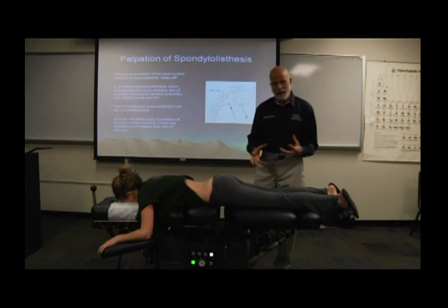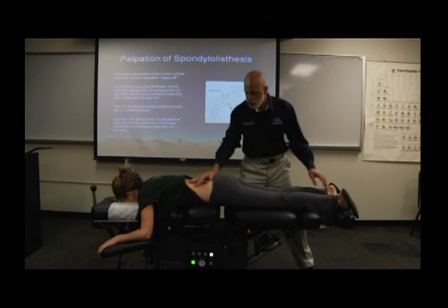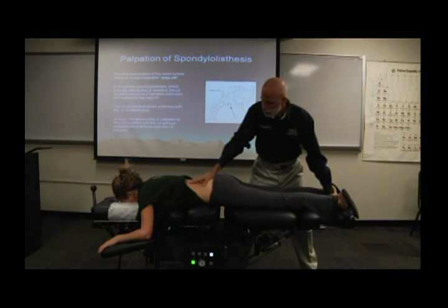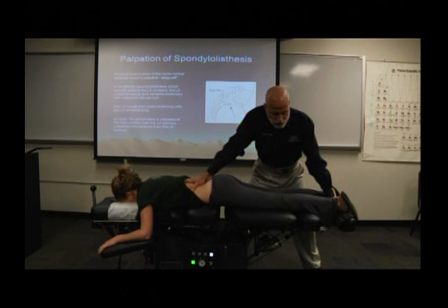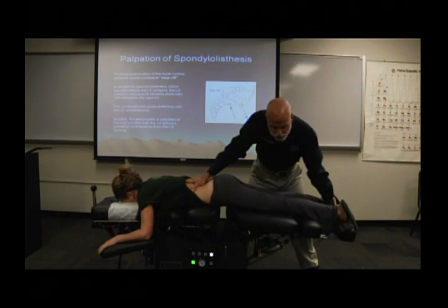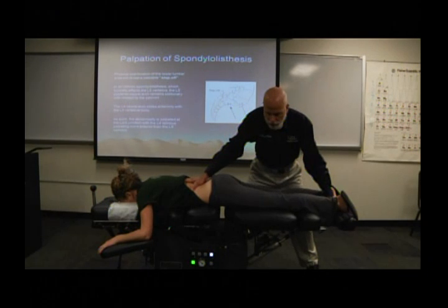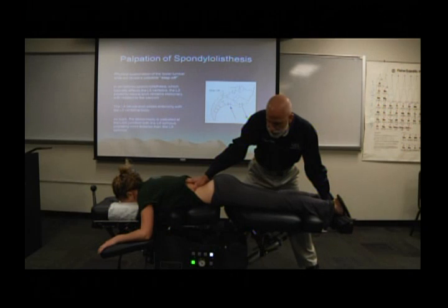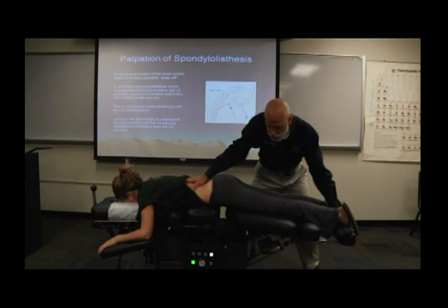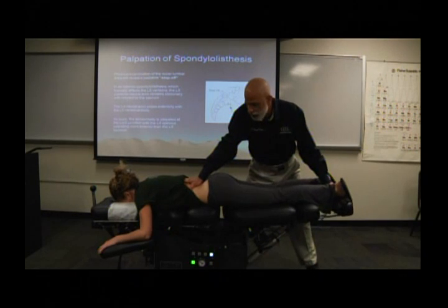Same scenario without a radicular component. Again, L5 spondylo, no radicular component. Make sure you get off of L5 and onto L4 spinous. Find the area of elastic resistance. Do your 10 2-second pumps. Release your lateral flexion lever. Find the area of elastic resistance, and then do your 10 lateral flexions left, 10 lateral flexions right, 10 circumductions left, 10 circumductions right, and then 10 extensions.